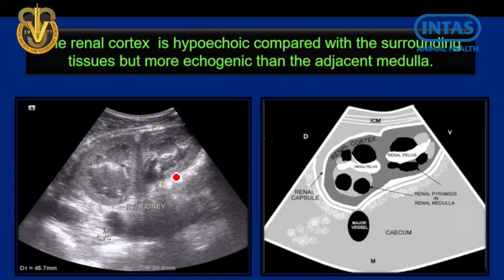So as you proceed from M, the kidney medulla, to the prostate, the echogenicity of the organs increases. So: my cat loves sunny places. Some sonographers say, for my cat loves sunny places. F means fluid, which is least echogenic. But whenever you're seeing soft tissue organs, follow the principle: my cat loves sunny places.